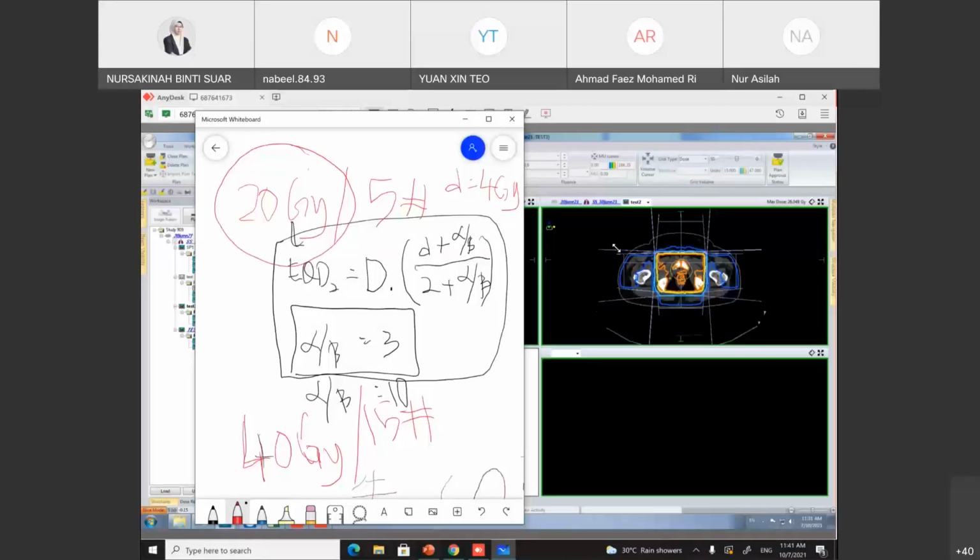You mean now the tumor is actually receiving low dose? Yes. Usually is it because of palliative? No, it's for all the cases. It's not only palliative. Radical also you need to know this one. Okay, miss. Thank you.